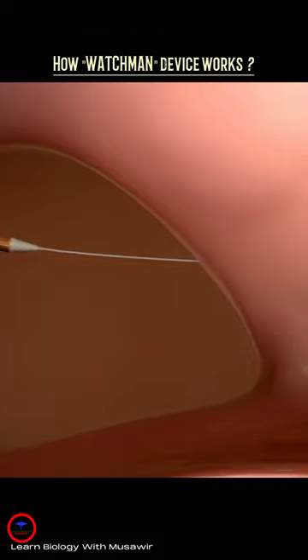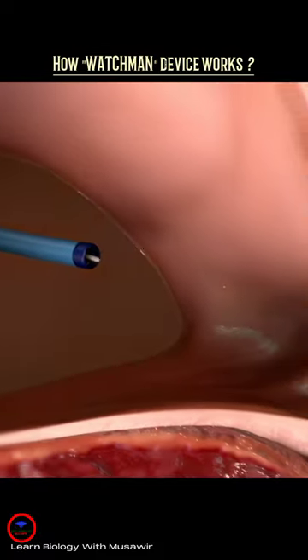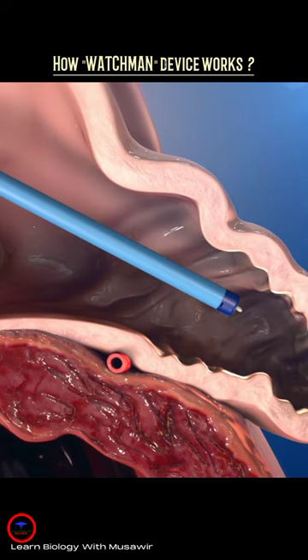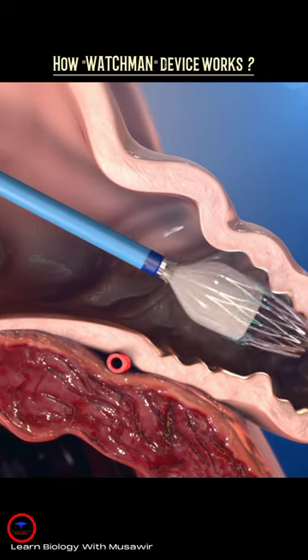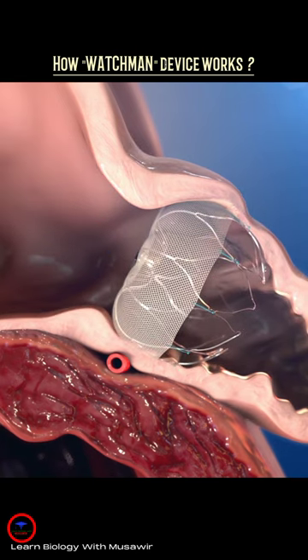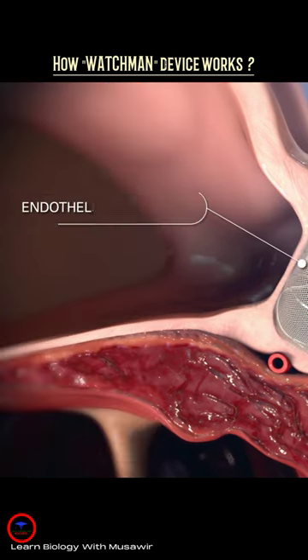The physician advances the access sheath over the guide wire into the left atrium and navigates it into the distal portion of the left atrial appendage over a pigtail catheter. The physician then deploys and releases the Watchman device. The device gradually endothelializes to permanently seal off the patient's LAA.